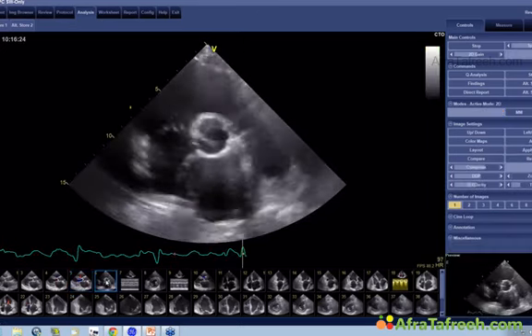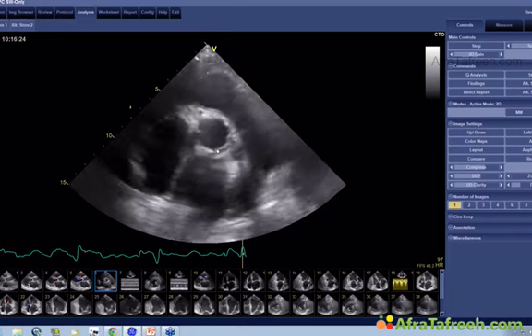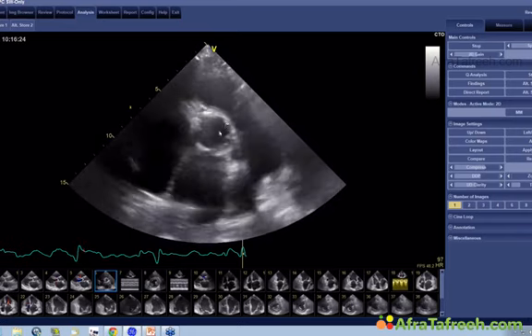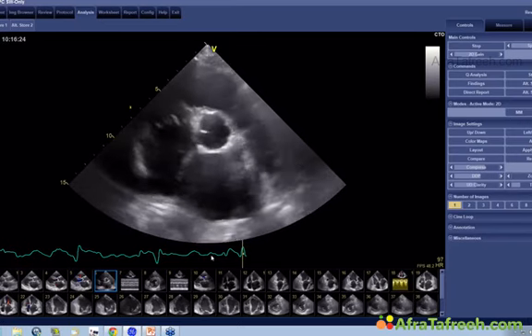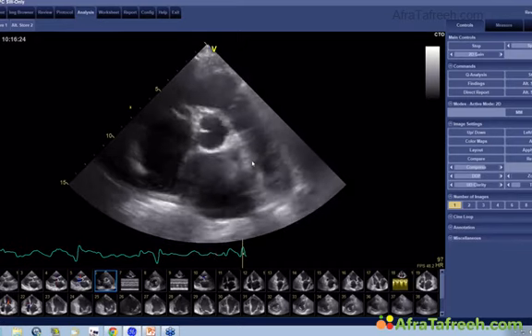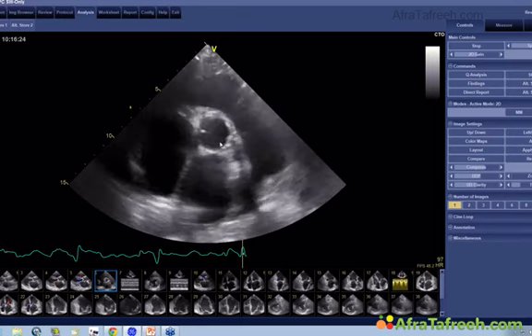Obviously, I then perform a short axis view to look at the mitral valve and the aortic valve to see if it's bicuspid or tricuspid, which in reality would not make any change in this patient. The only thought that I have is that if someone is 92 and has a bicuspid valve, he probably would have stenosis too. So I'm sure that this is basically a tricuspid valve.